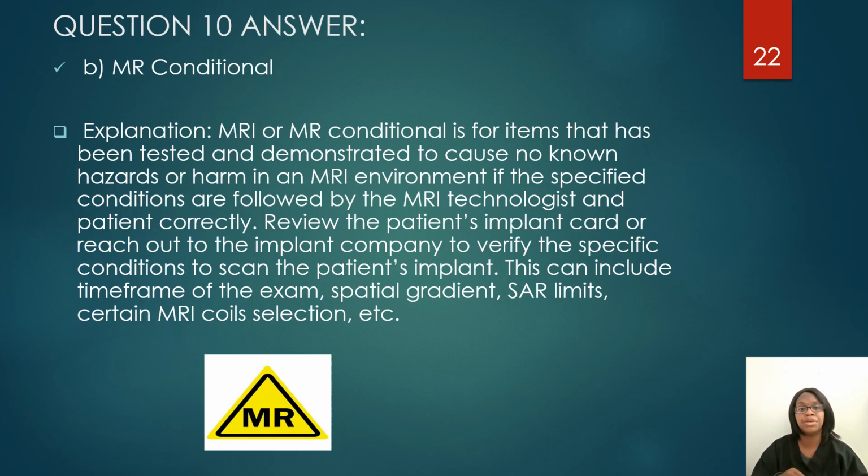If they have this label, number one, I always ask for their card to verify what they have in their body, because they may tell you they have a stent in their brain, but they end up having an aneurysm clip.